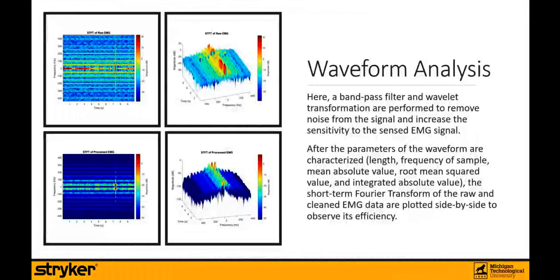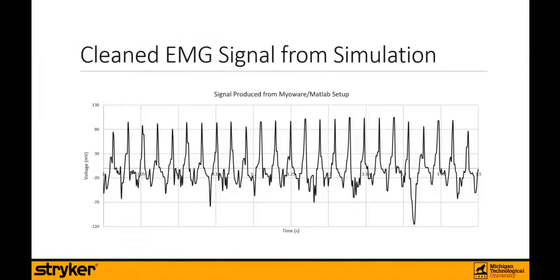This is an example of one of the results from our software solution. We applied a bandpass filter and performed wavelet transformation on the received EMG signal to remove the noise and to increase the sensitivity to the EMG signal. This is an example of the cleaned EMG signal that we're able to achieve using our software solution.